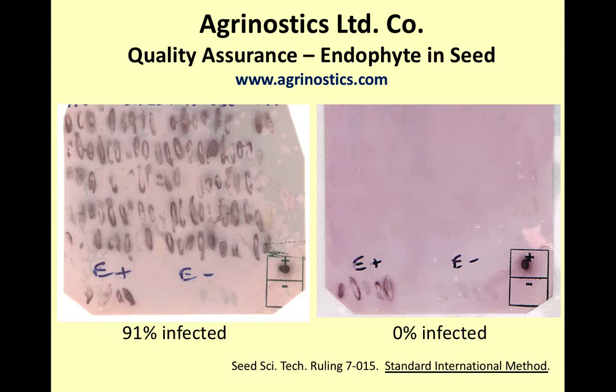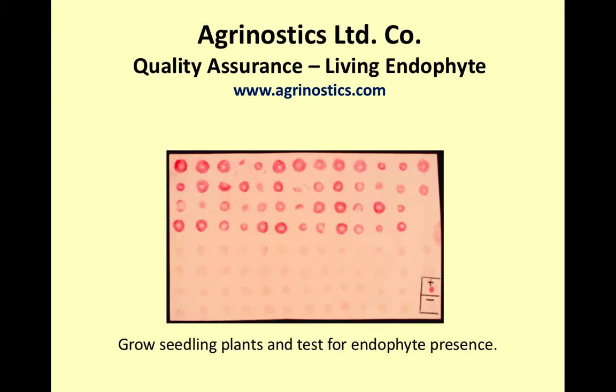This is what our test looks like. It's kind of the same concept as home pregnancy testing. Okay, this is immunology-based testing. So here's a membrane, or an image of endophyte-infected tall fescue seed. Here's an image of endophyte-free tall fescue seed. That particular lot right there was 91% infected. This is endophyte-free.